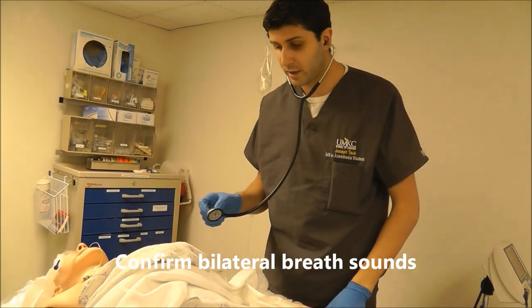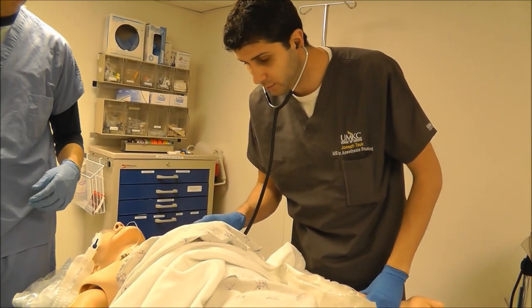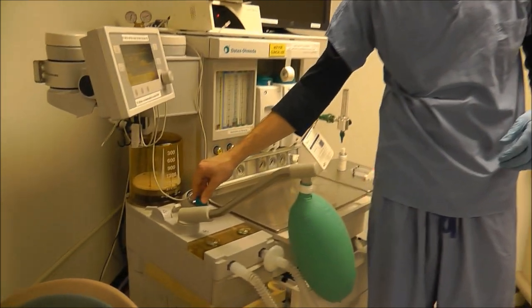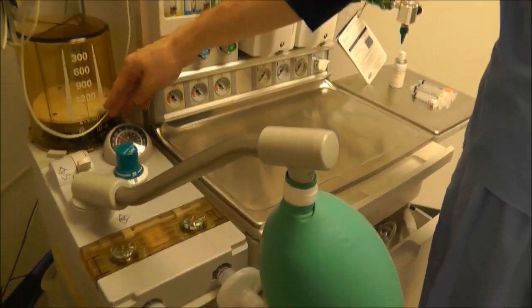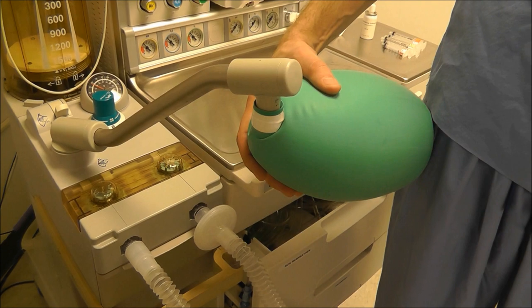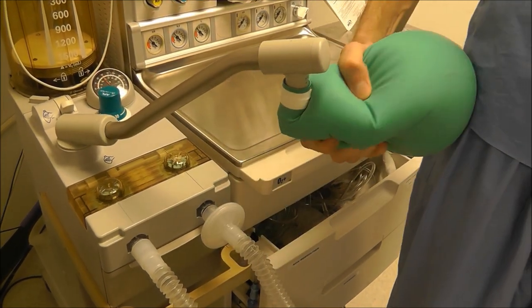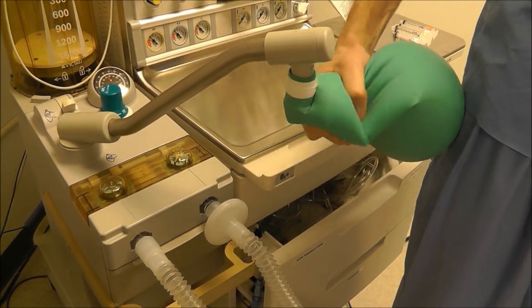When checking for breath sounds, I want to make sure that I'm pressing down firmly. What I'm supposed to be doing is make sure that I go to bag mode, turn my APL valve closed, and squeeze hard and fast so that breath sounds can be heard as clearly as possible.